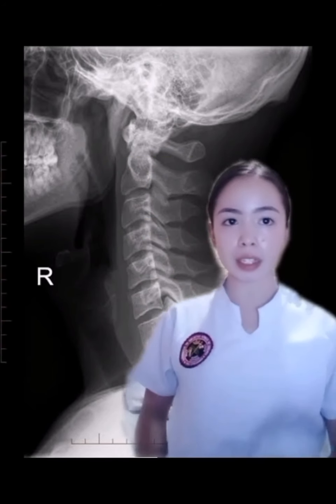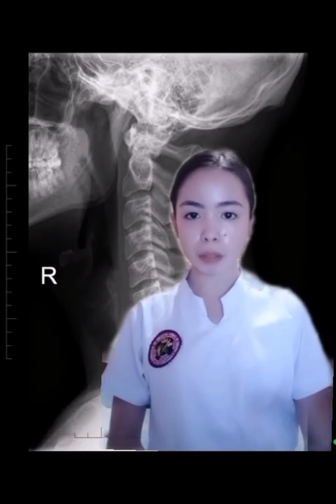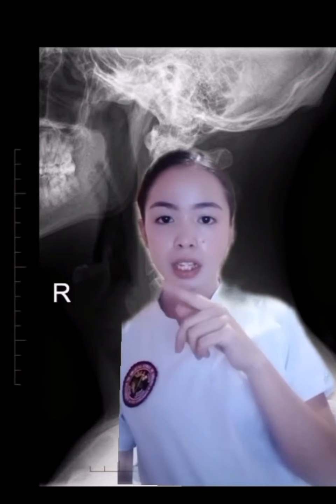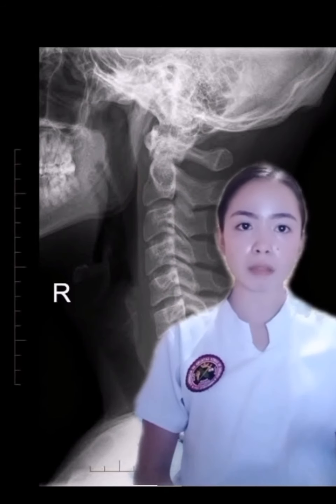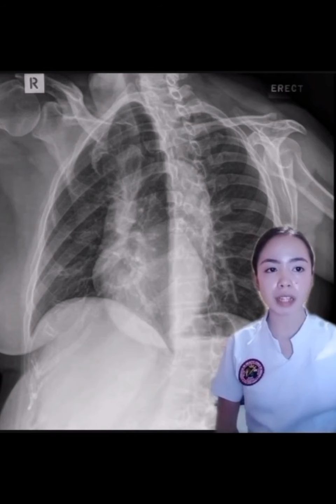So this is the cervical spine, this is the anterior part of the patient, and this is the posterior. So we are going to put the marker right here in the radiograph. So in this radiograph, the patient is in right lateral position, meaning the right side of the patient is near the cassette. When the chest, abdomen, or spine is being radiographed in an oblique position, the side nearest the film is generally marked. So in this radiograph, the patient is in right anterior oblique position, therefore the marker should also be in the right side of the cassette.